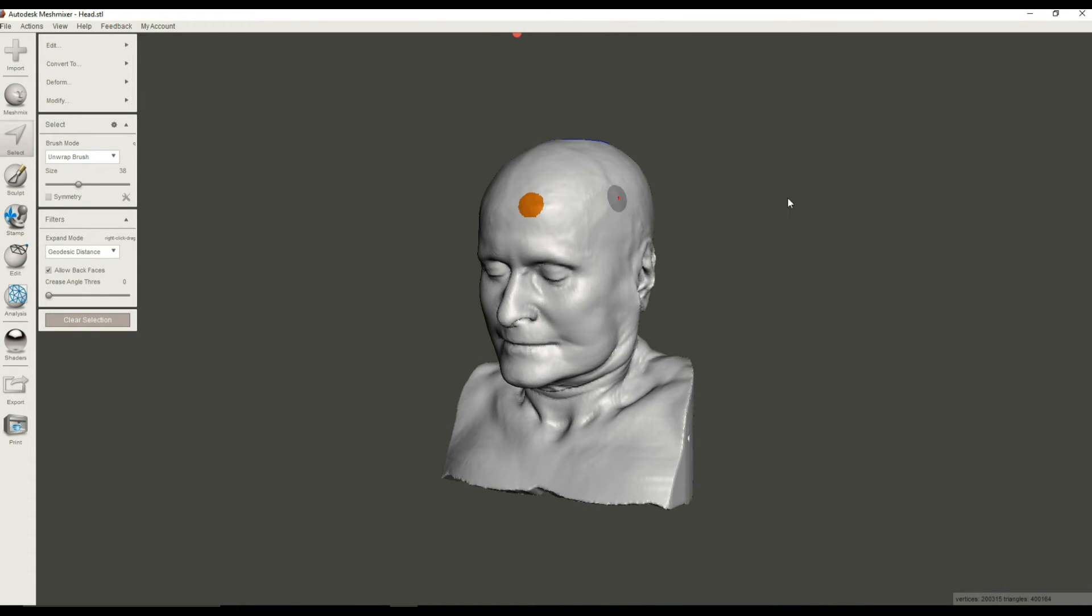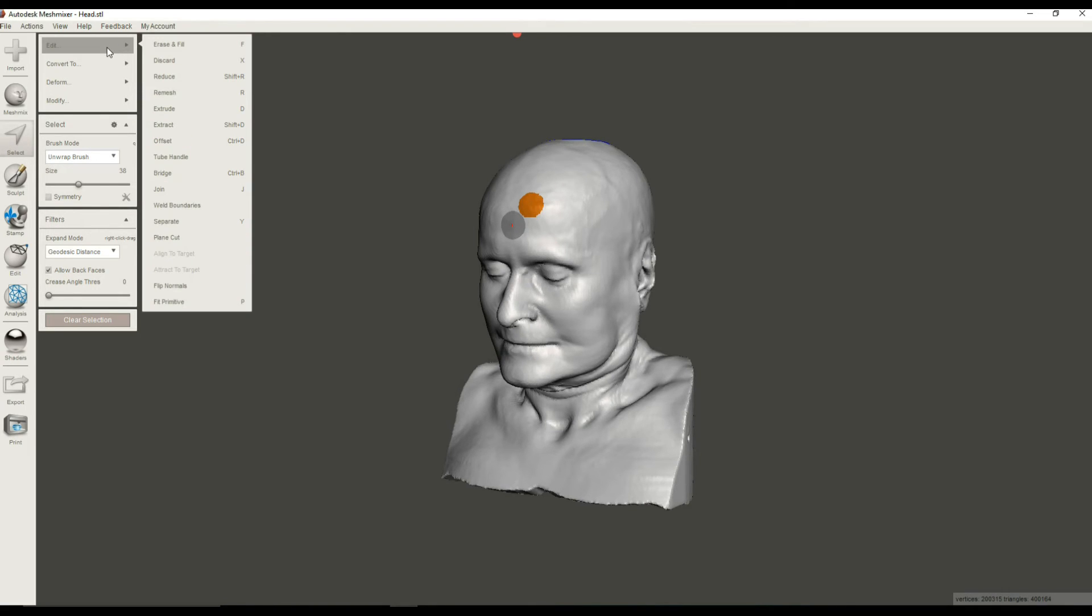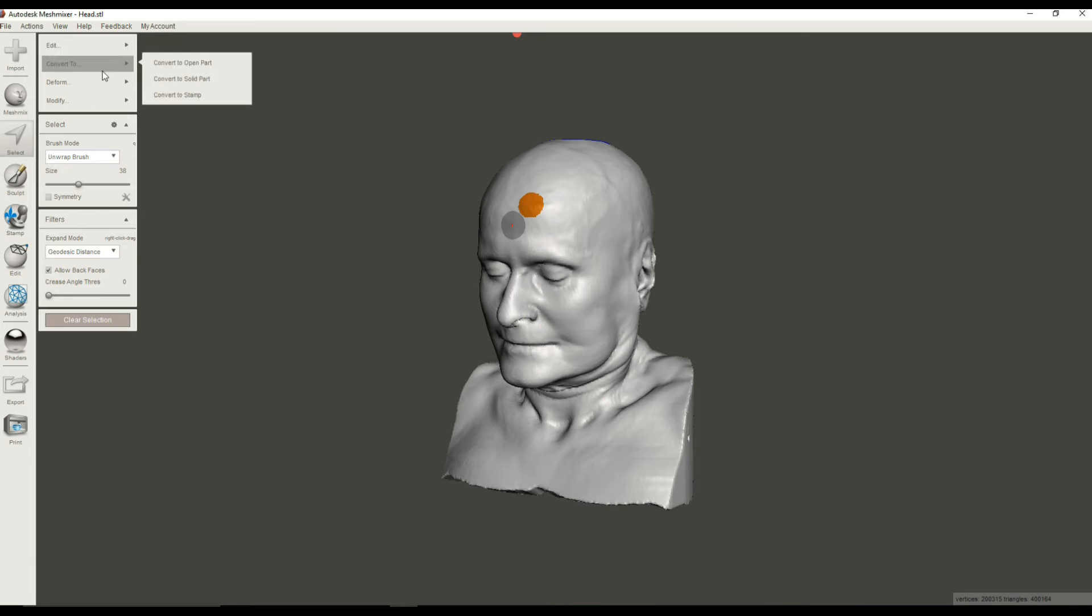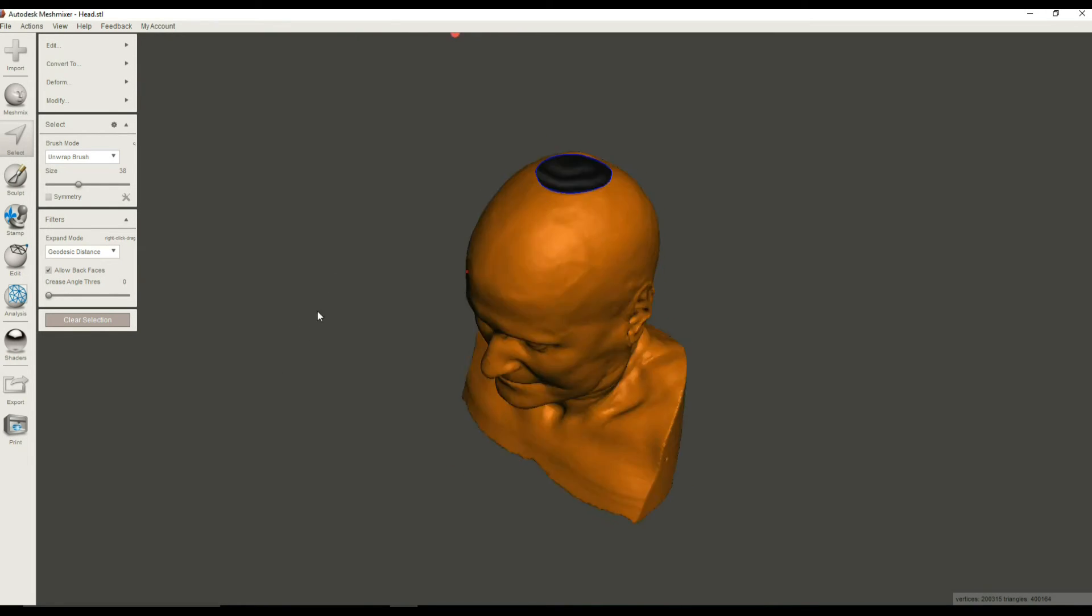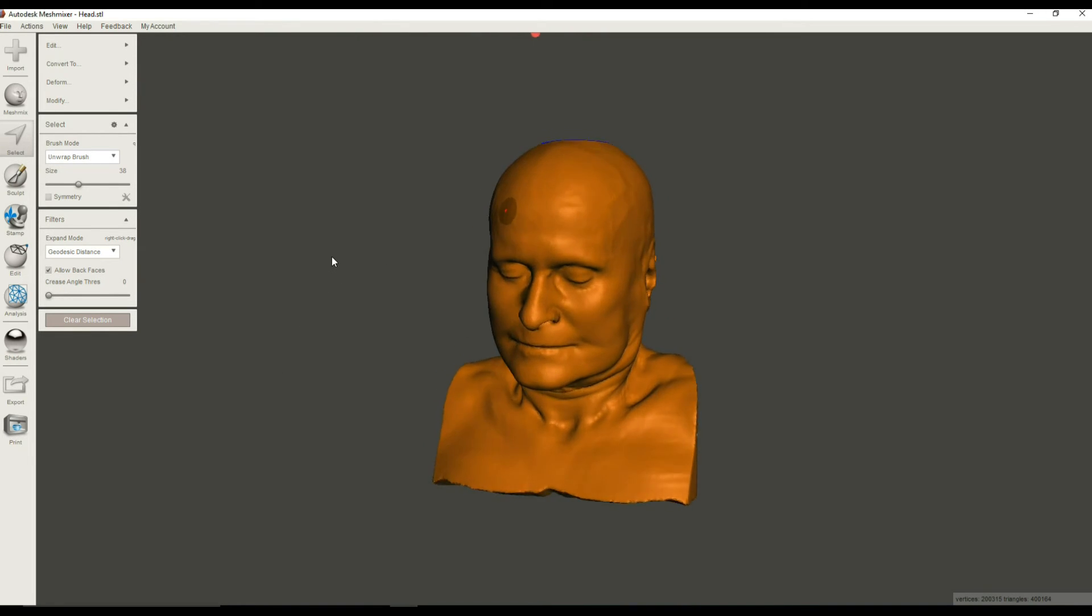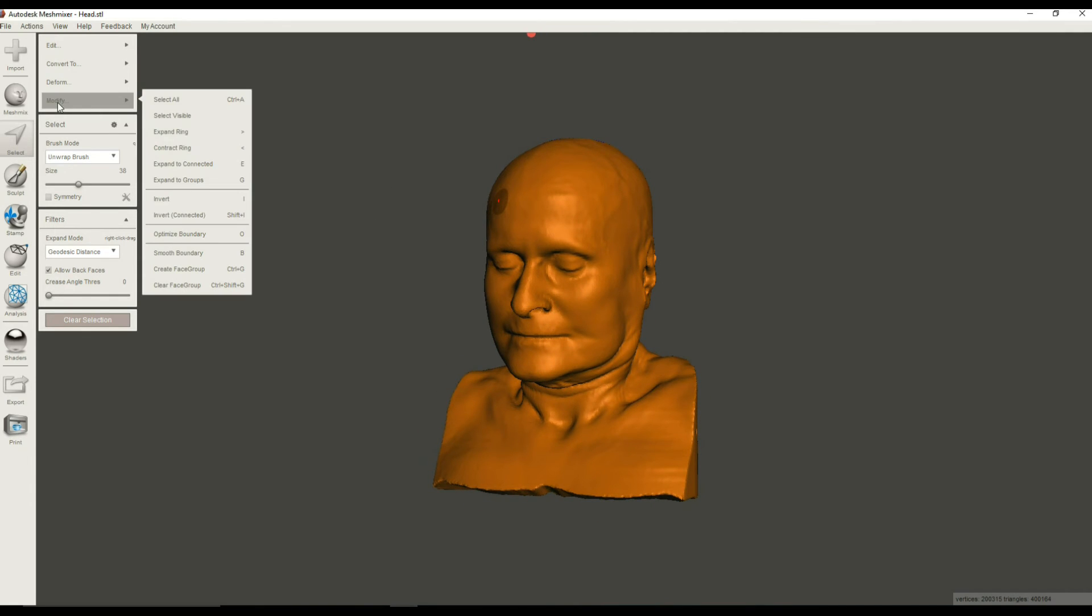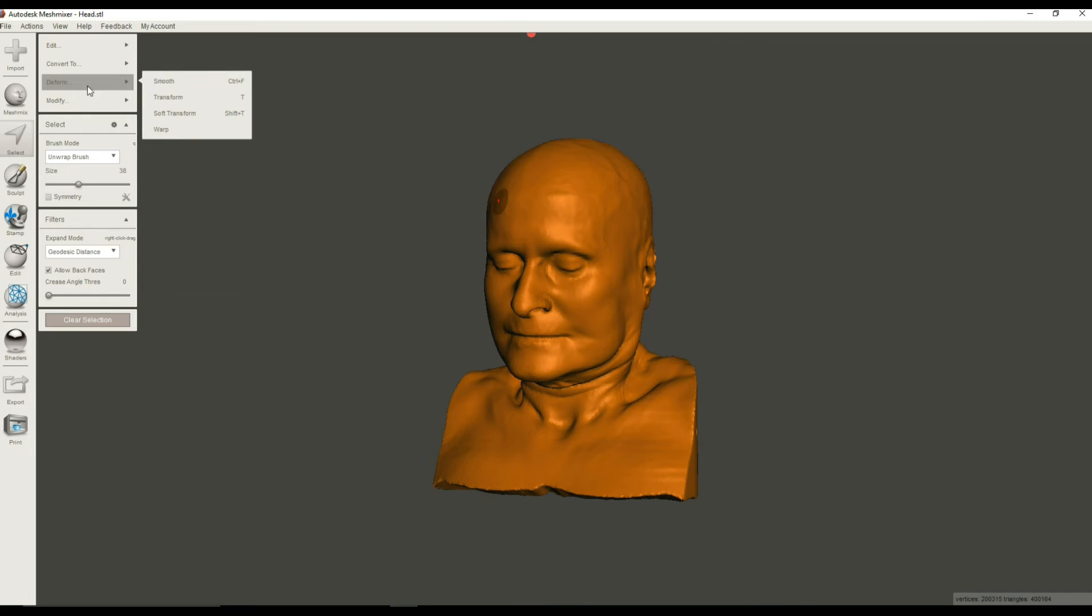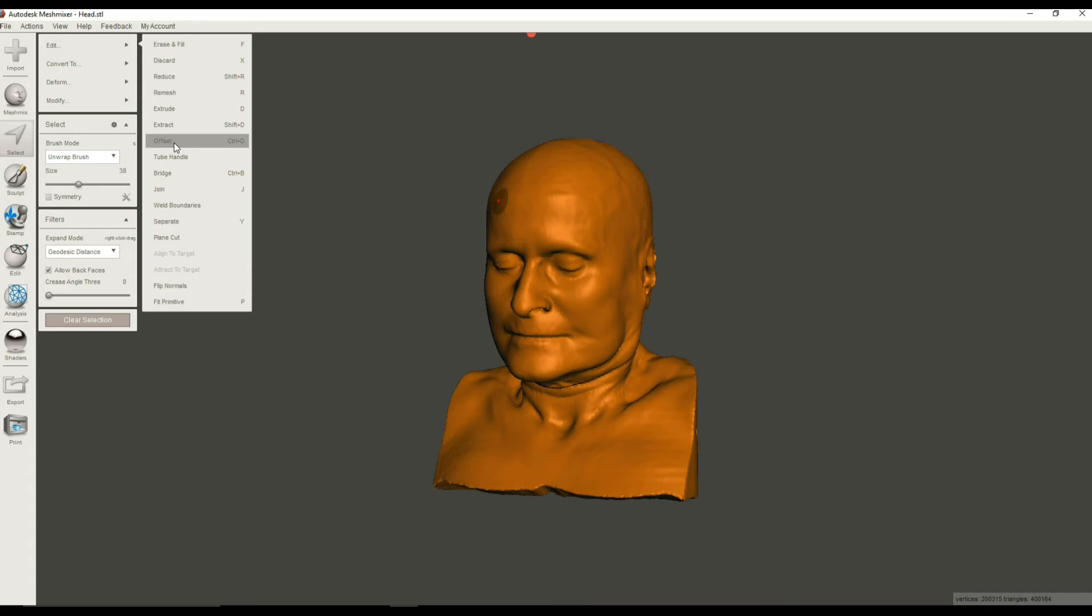Let's just select some part of it. Hit Control-A to expand that selection and select everything. Okay. And so everything that's selected is now an orange, which is everything. And let's go ahead and modify this. We are going to do an offset. So go to the Edit, and under Edit, select Offset, or you can hit Control-D and select that. And what will happen is Mesh Mixer will think for about a minute or two.